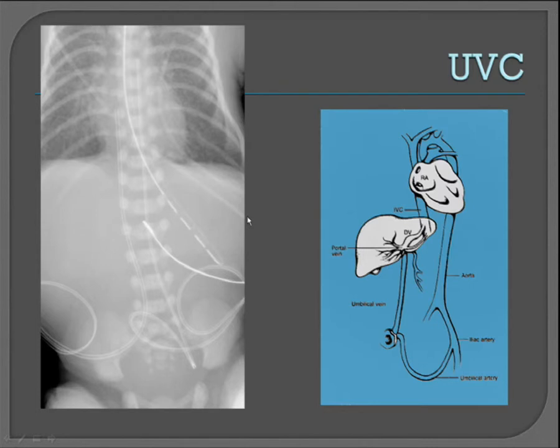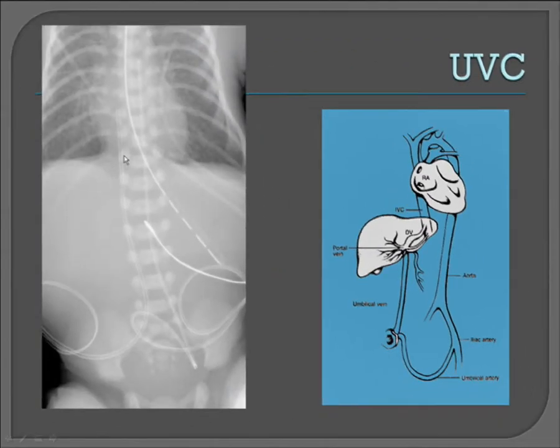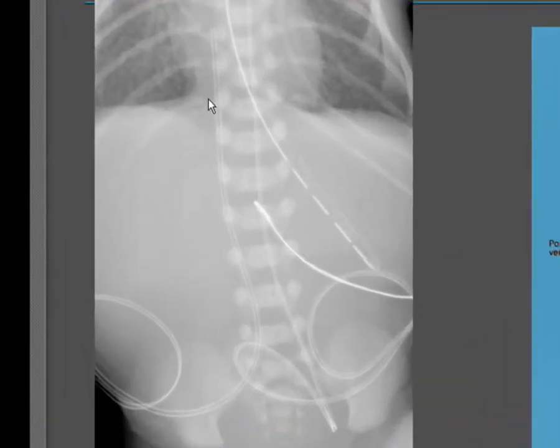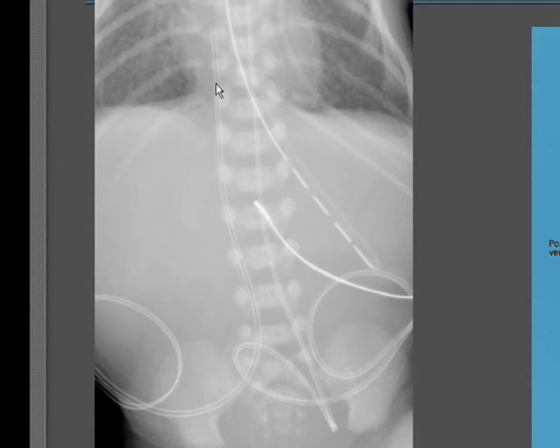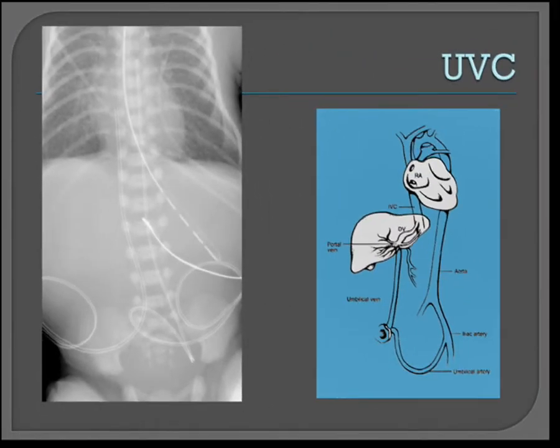Now to talk about UVCs. UVCs take a more anterior course in the body, and you can see it coming in through the umbilical vein. It comes up to the portal sinus, or the junction of the left and right portal veins, then goes into the ductus venosus, through a hepatic vein, and then into the IVC. It should terminate around the level of the diaphragm at the junction of the IVC and the right atrium. This one is a little bit too high — it terminates in the right atrium. Here we can see it coming in through the umbilical vein, up towards the liver, towards the portal sinus, into the ductus venosus, into a hepatic vein, up into the IVC, and then into the right atrium.